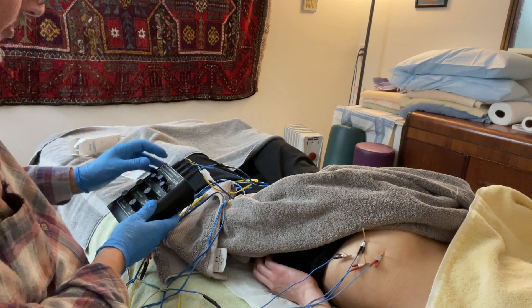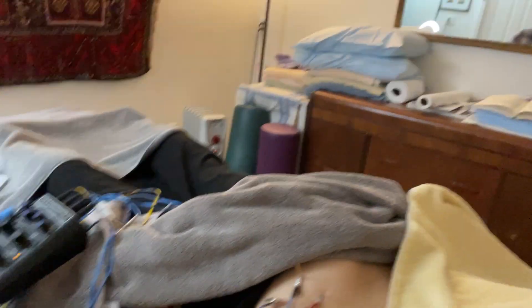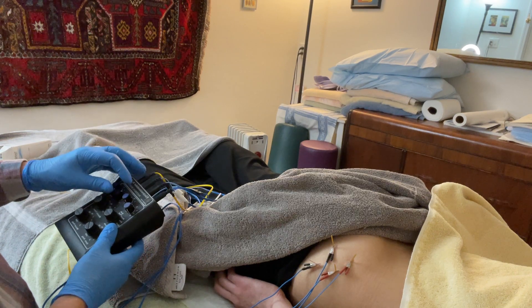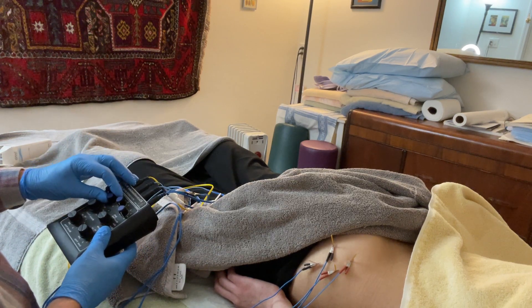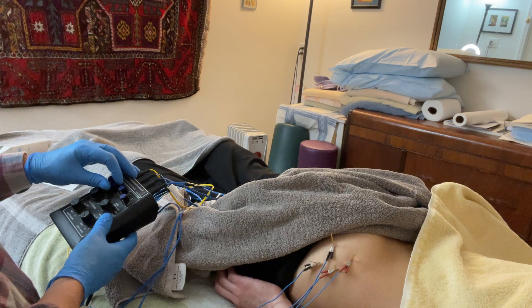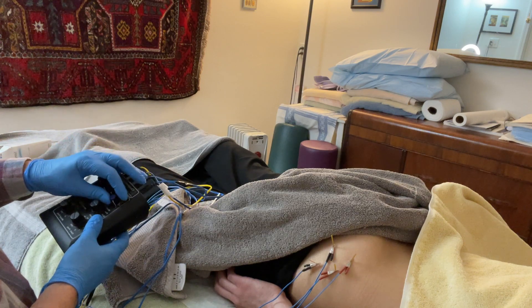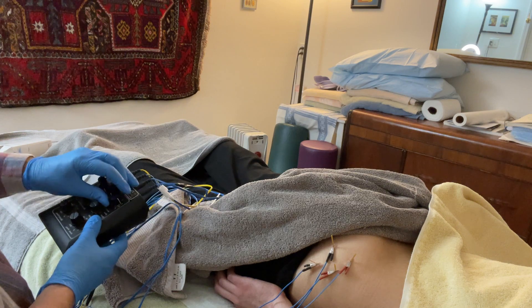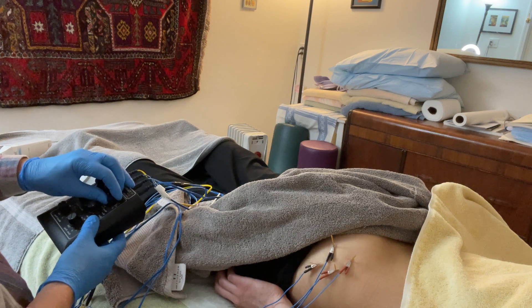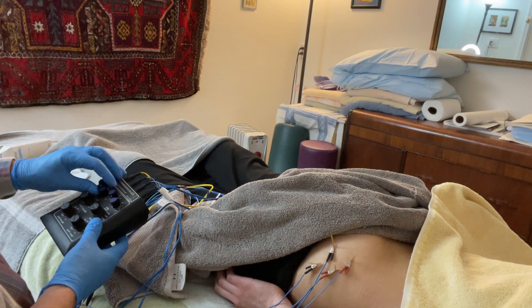Let me know when you start to feel it. I feel it, but it could be a lot stronger. I've turned on one of them and these clips are pretty close together. I'm going to turn it off so I can turn the second one on and see if they're getting different tissues, or if they might just get the same tissues because they're so close together. Does it feel like the same spot? A little different.